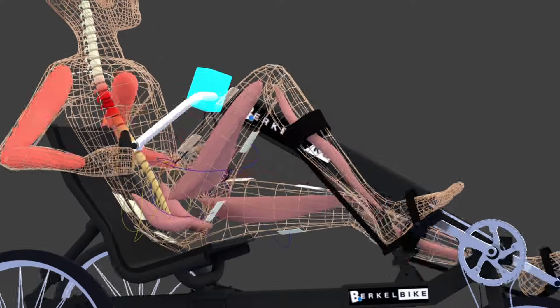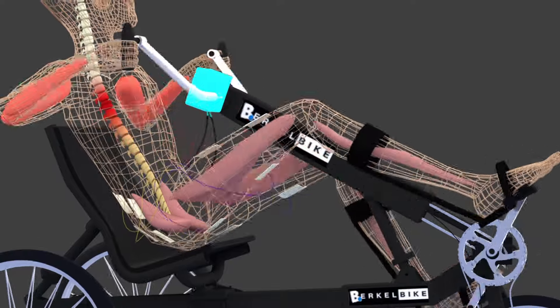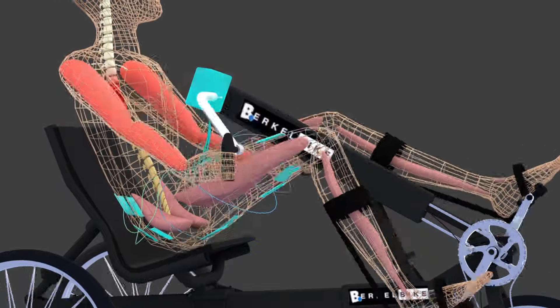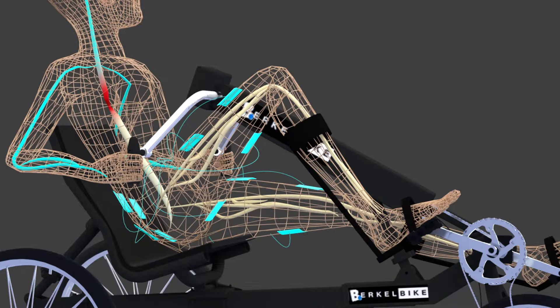A sensor detects the position of the pedals and the speed at which they circulate. This information is forwarded to the stimulator on the steering wheel of the tricycle. The stimulator then calculates which muscles should be activated and sends electrical impulses to 12 electrodes in the shorts that Paul is wearing.